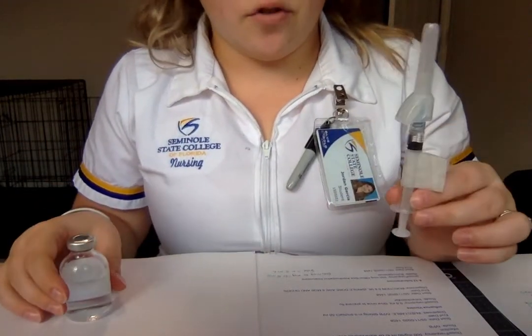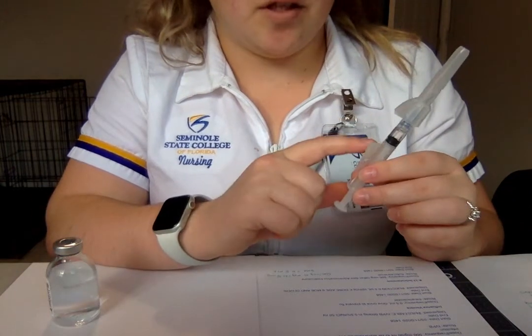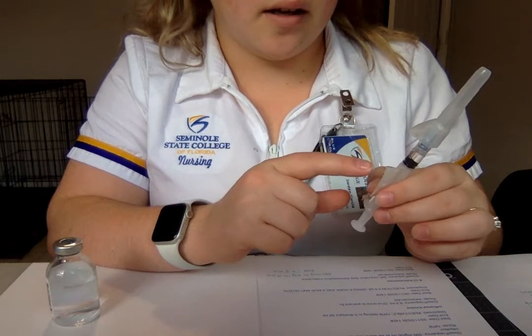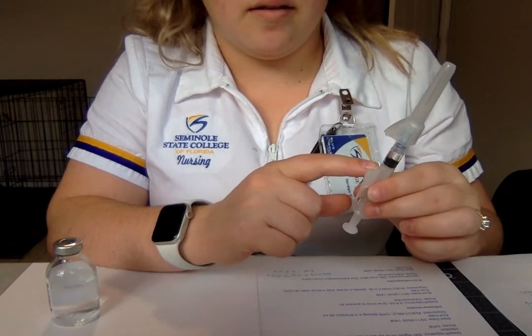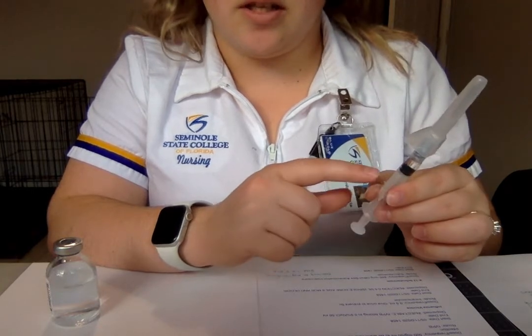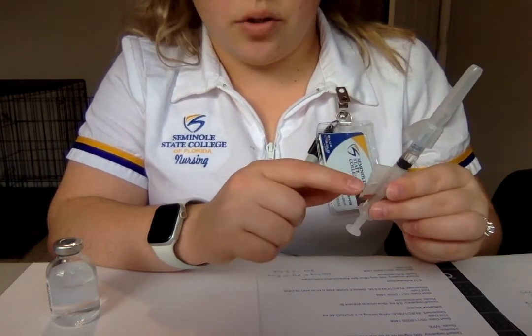And then now that I've drawn this one up, I will go ahead and label it with the patient's name, patient's date of birth, the medication name, the dosage, the time, and my initials. And I would set this aside right here.